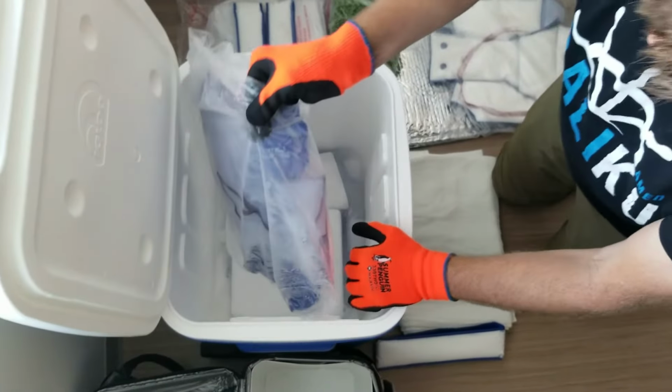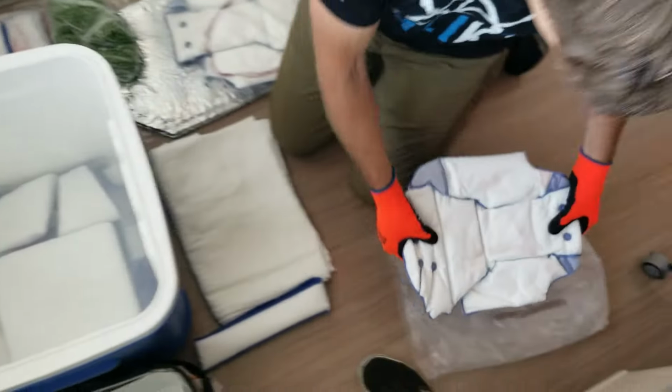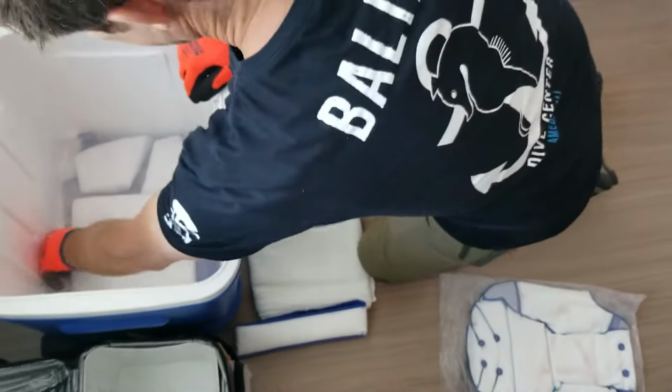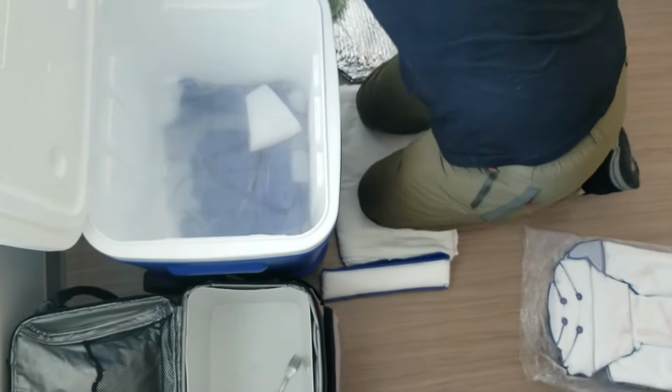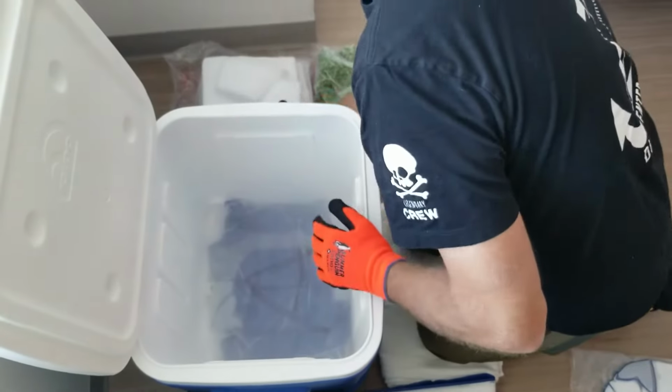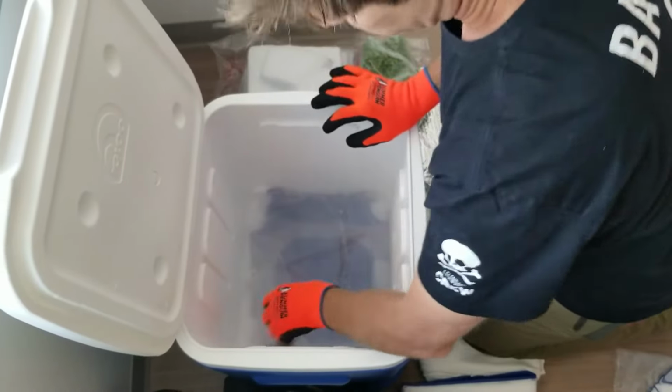The next one I come to is the one I want to take out. So in order to remember, I just take it out of the bag and set it aside. I don't do anything with it right now. Got another layer of ice, as you can see here. I just take that out. Dry ice, set it aside. I got these big chunks, and if you just set it on, you can actually break it. So this is the coldest one right now.